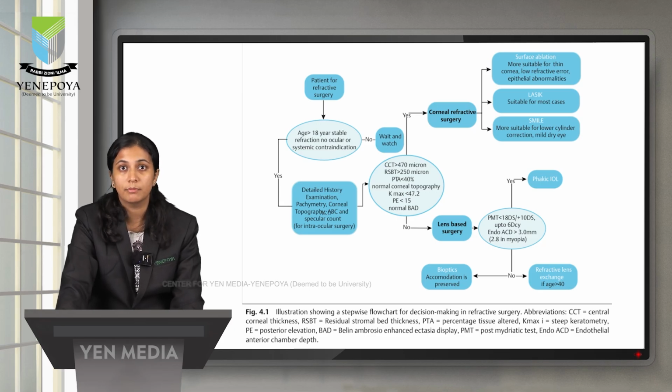Now, if they are not met and if the patient is above 40 years of age with a loss of accommodation, you can take up the patient for refractive lens exchange. Or you can take up the patient for bioptics. Bioptics is where both lens-based and corneal refractive surgery can be done together.